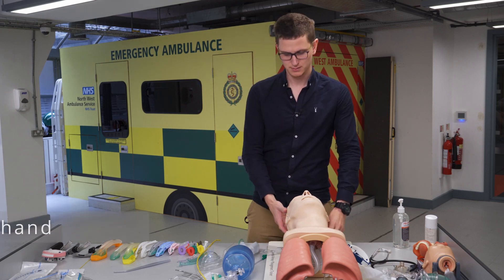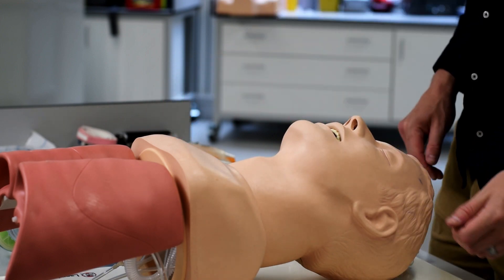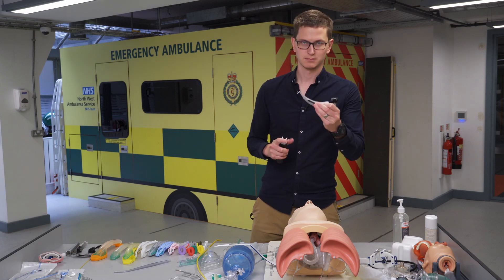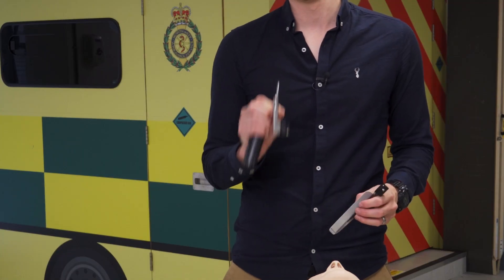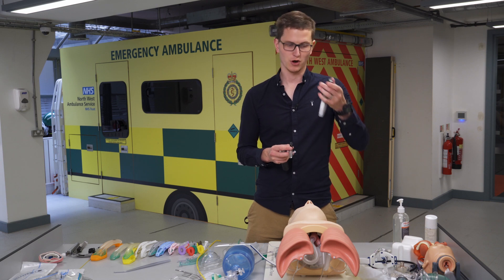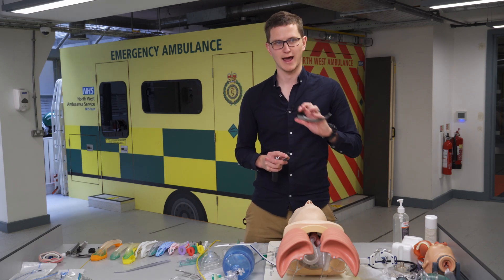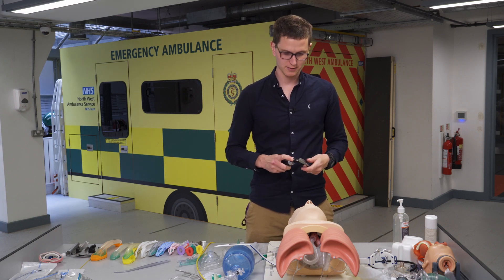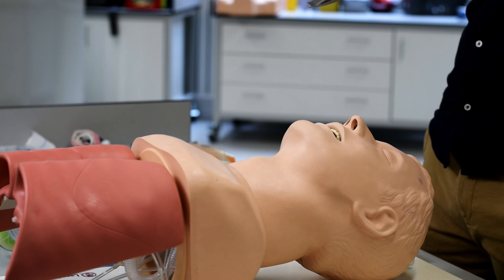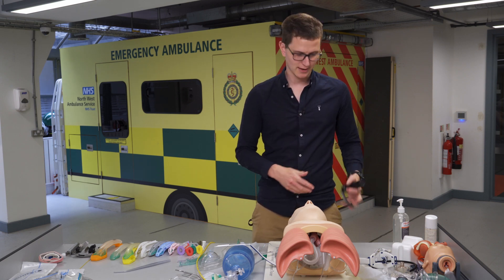You also need something to secure the tube — a Thomas tube holder, which is used for both the iGel and the ETT. You need a laryngoscope. Here is a MAC size 4 blade — MAC is the curved one, and the Miller is the straight blade. For the Miller, you go straight down the middle of the tongue and lift up; for the MAC, you go to the side, scoop the tongue out of the way, and lift up. Normally adults get the curved blade. The laryngoscope goes in your left hand as it's a left-handed device.